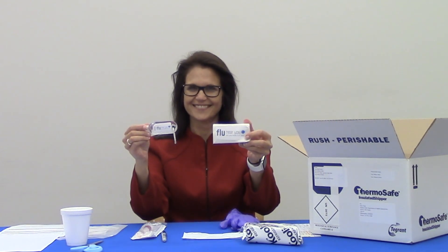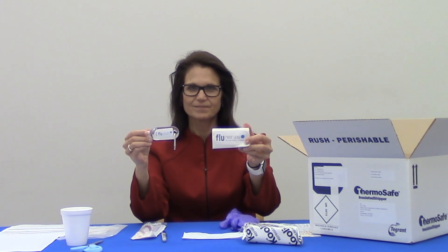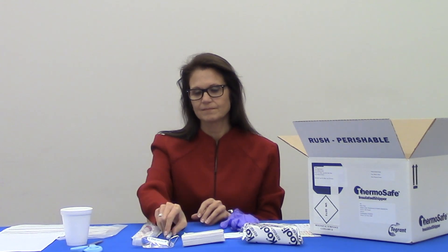Your swab kit may also include hand sanitizer and a pack of tissues with the Flu Near You logos — these are yours to keep and are not necessary for specimen collection. Before you take your specimen, you will also need a pen or thin permanent marker, packaging tape to close the shipping box, a small cup, and optionally scissors.